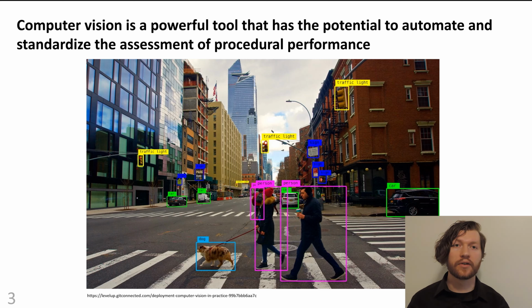Step order, sterile technique, and sharps management are difficult to assess using traditional sensing methods without inhibiting freedom of movement. Computer vision, on the other hand, only requires line of sight and can therefore remain out of the way of the user. Computer vision, paired with machine learning and artificial intelligence, is a powerful tool that has been used to classify diseases, automate image segmentation, and detect cancer.